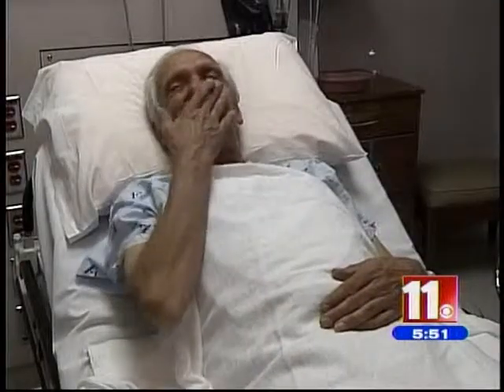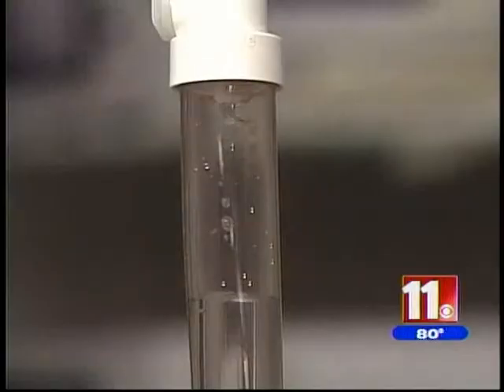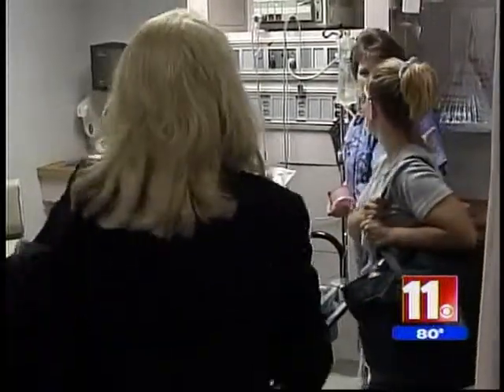When 67-year-old Jack Murray started noticing blood in his urine, he initially thought it was an infection, but further testing found it was much more serious. So he went in to scrape it and found a tumor. Cancerous tumors, like Jack's, require the removal of the bladder through a 1.5-foot incision. But Dr. Ronney Abaza offered Jack a new procedure that removes the bladder through a 3-inch incision using a new robot called Da Vinci. For Jack, there was no question.